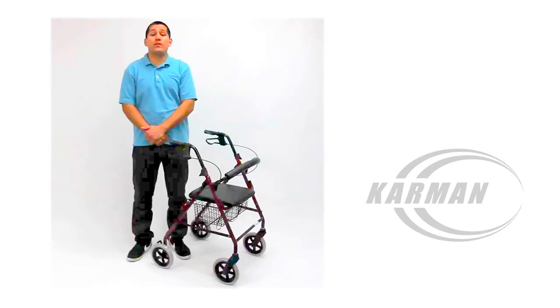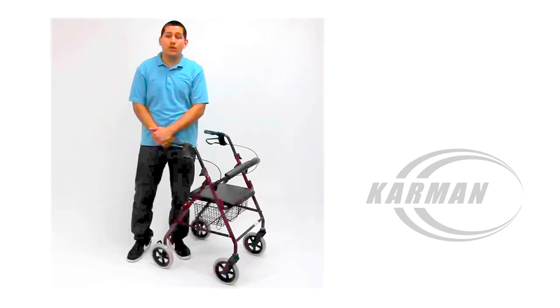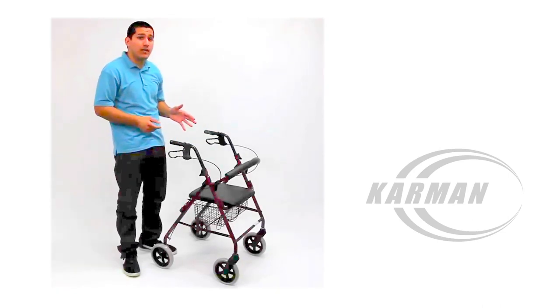Hello again, Edward here with Karman Healthcare, and today I will be demonstrating to you our Rollator R4608.